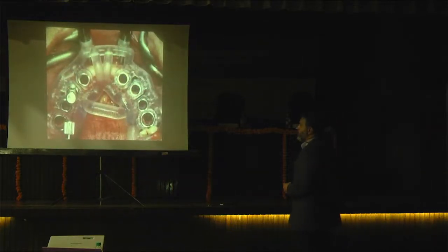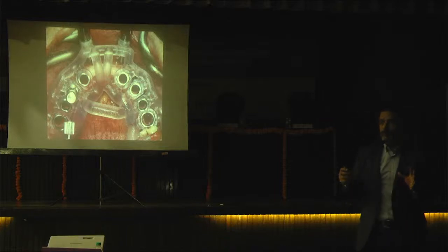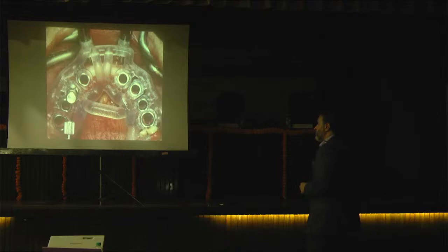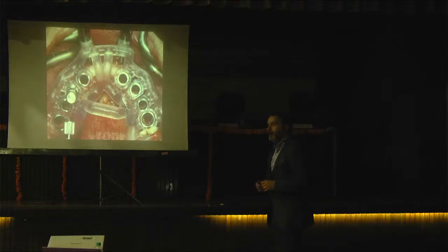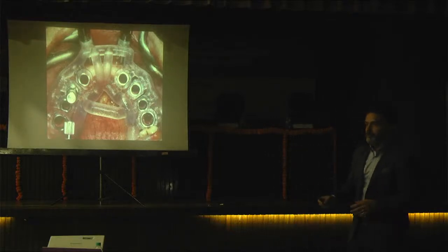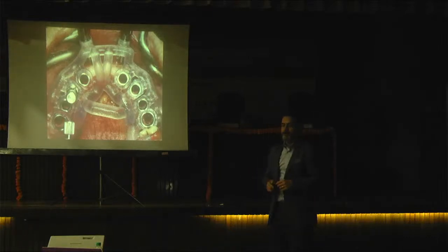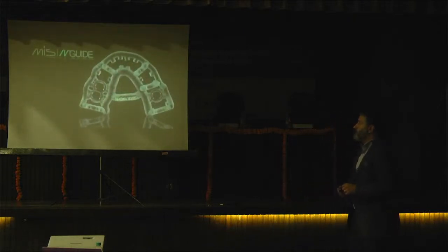So, our guide, M-Guide, is something like that. It has sleeves, and once you fix the guide in the jaw, it doesn't move, and it is very easy to make the osteotomy when you follow the protocol and try to do the good things and the correct things with patients. Then you should reach your goal. This is M-Guide.